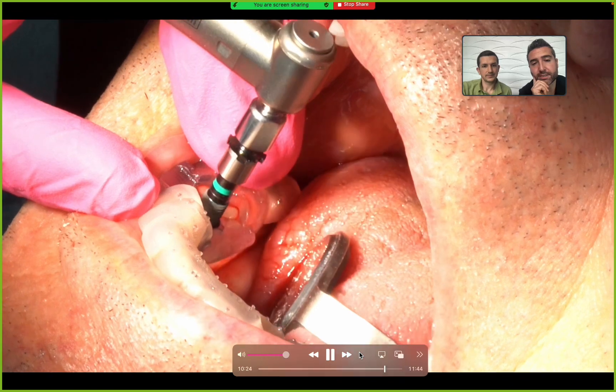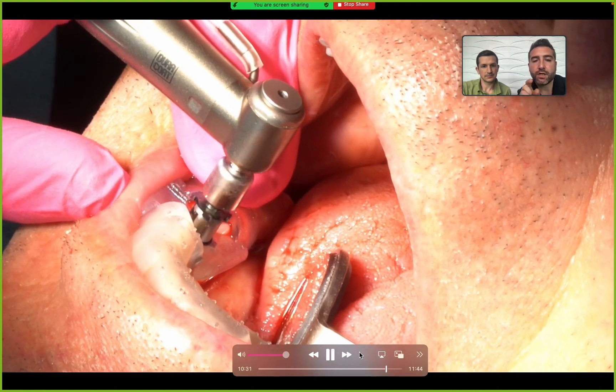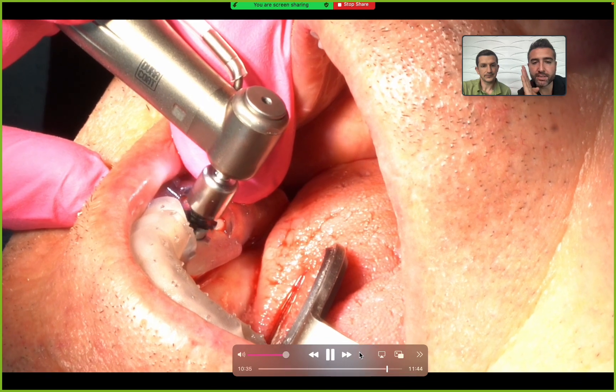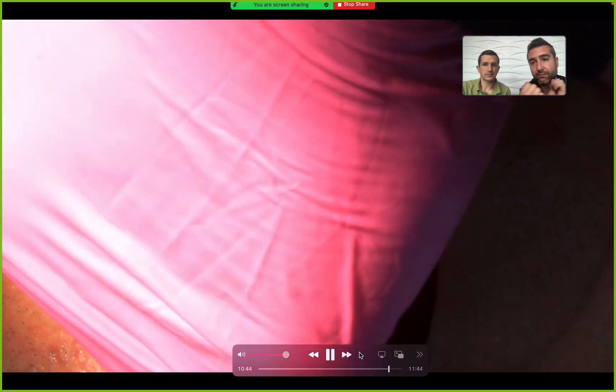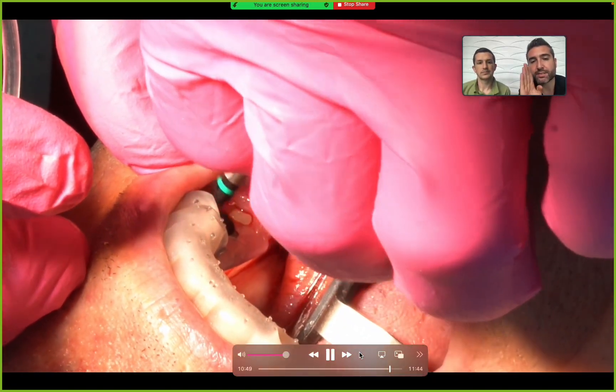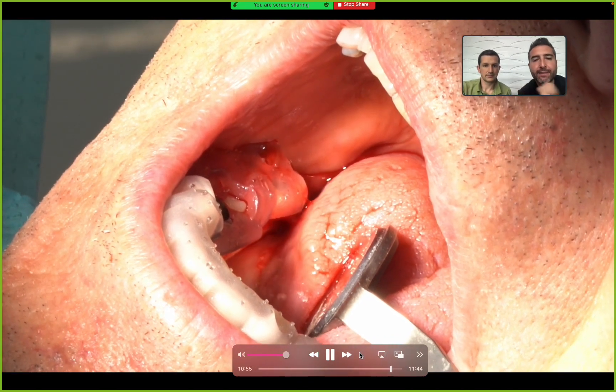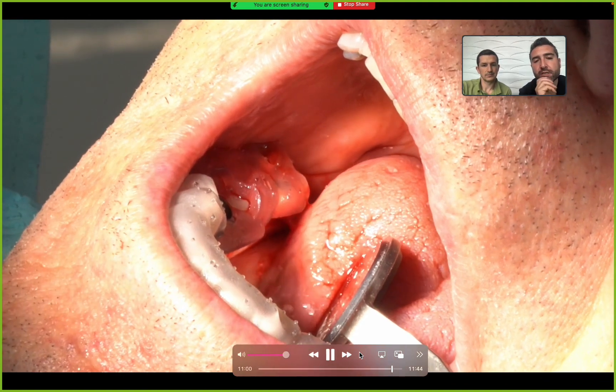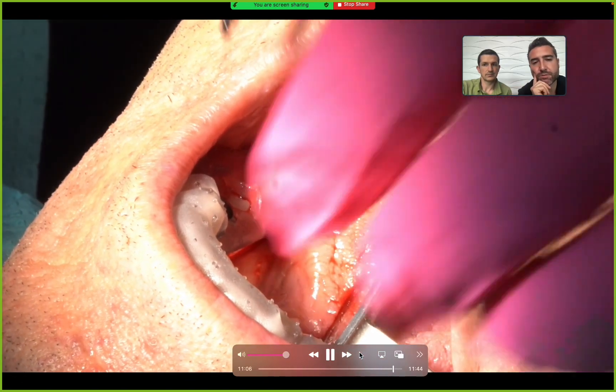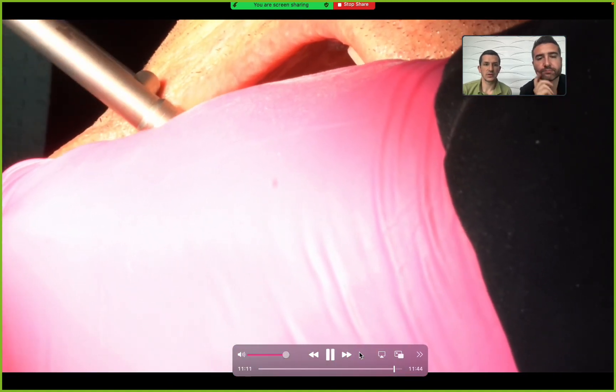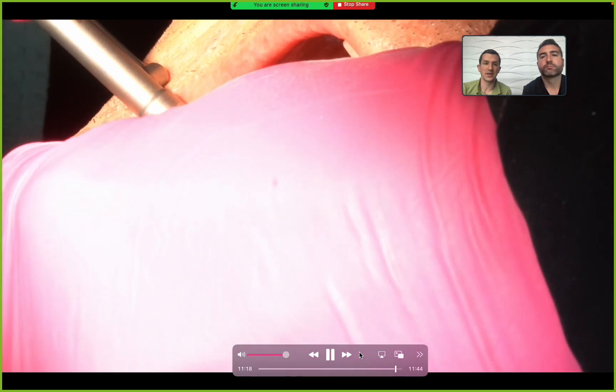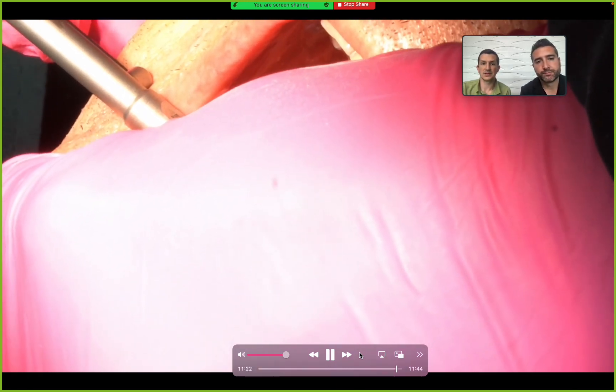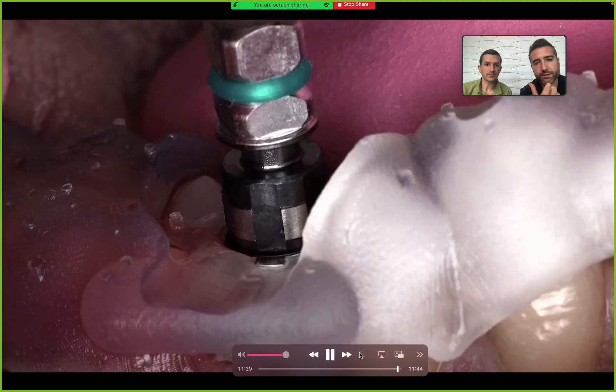Here's the implant - a Urus regular implant. You can see the notches on the driver and little slots. Each slot corresponds to a flat spot in the hex, which lines up to the notch on the sleeve. It's depth controlled, so you can't screw up. You can fine-tune it with the last rotation with a driver to line up the notch and get the timing right. We switch to a manual driver for the last quarter rotation to get it absolutely perfect, which is essential for a timed interface. It's actually an internal conical connection with a pretty aggressive platform switch. The ability to time guided surgeries has changed the way I practice implant dentistry - having custom healers ready to go, immediate temporization. It makes these surgeries so fast and stress-free.